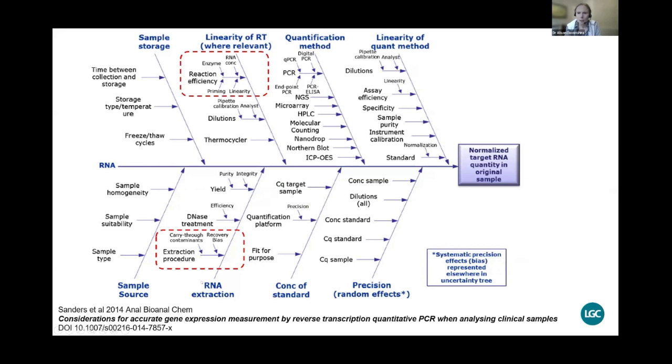So again, obviously maximizing the RNA extraction efficiency is going to also give you better sensitivity in terms of detecting MRD, and part of having that reference gene as the control is really reflecting part of that efficiency.